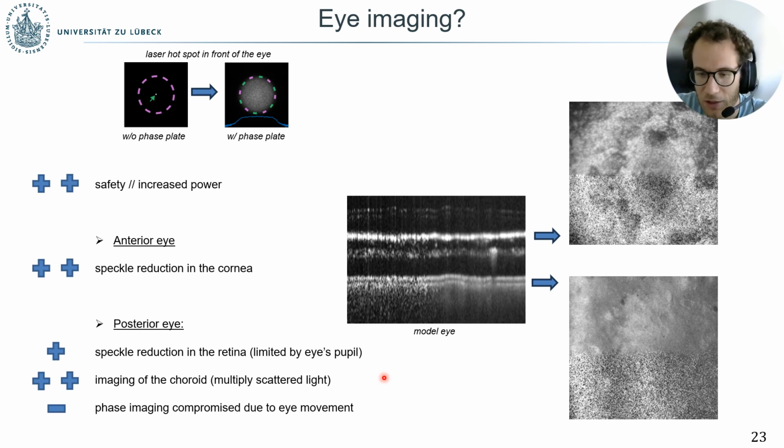So when we're trying to track the phase changes intrinsic to the pixels, to the physiology of the eye, we cannot distinguish what is due to the change in illumination or changes in the intrinsic phase of the pixel.